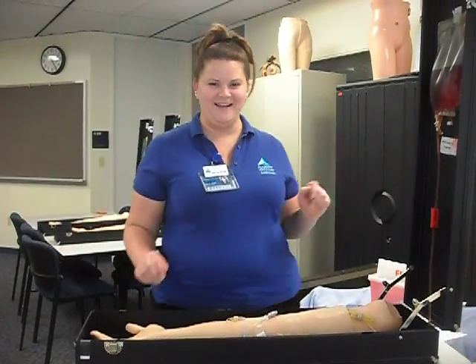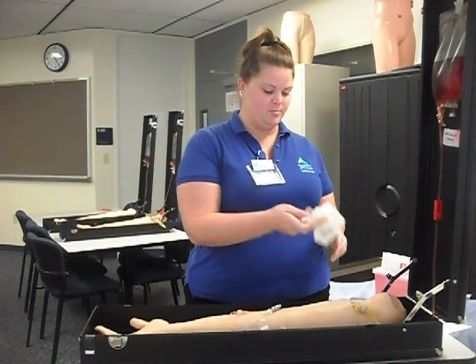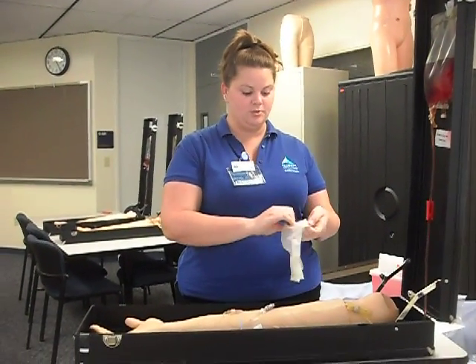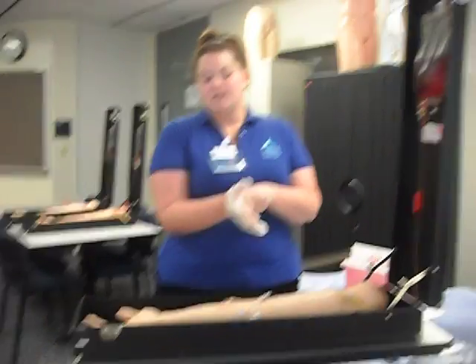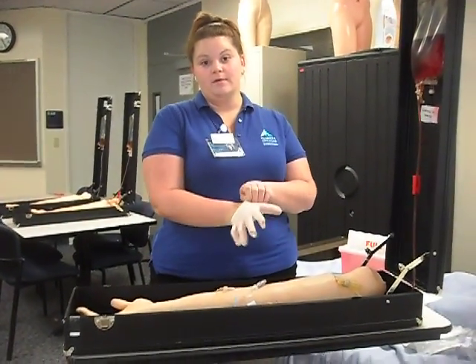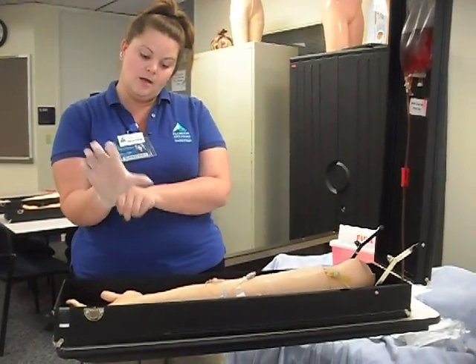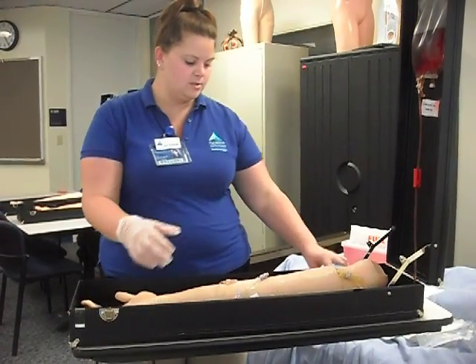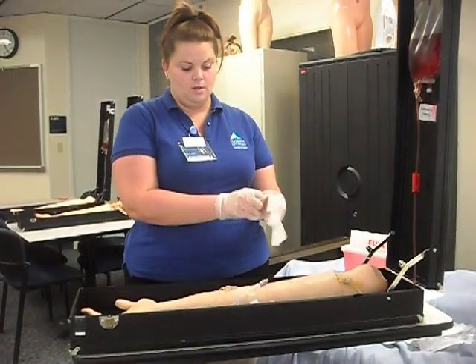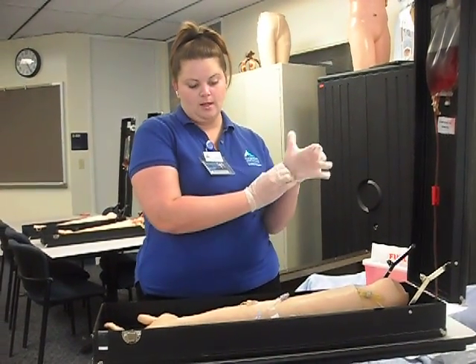I'm going to wash my hands, and I am going to put on some gloves, and I'm going to ask the patient to ID themselves. So I'm going to ask them to give me their name and date of birth, and I'm going to compare it to their armband. And in this case, it's the right patient, so I am going to get ready to start their fluids.